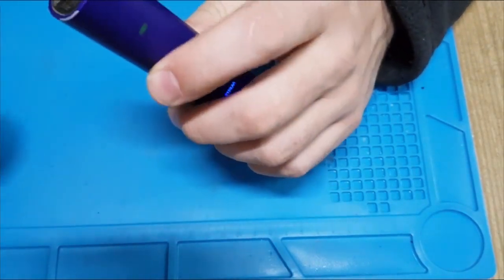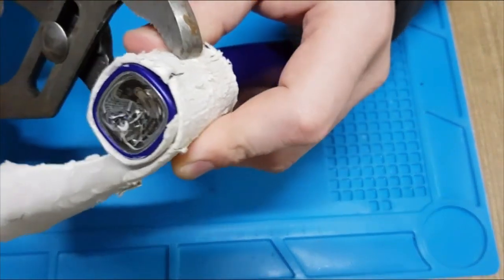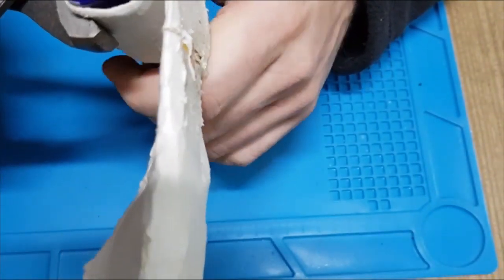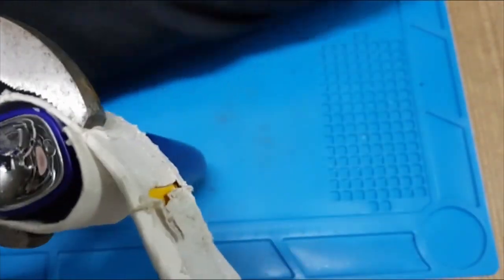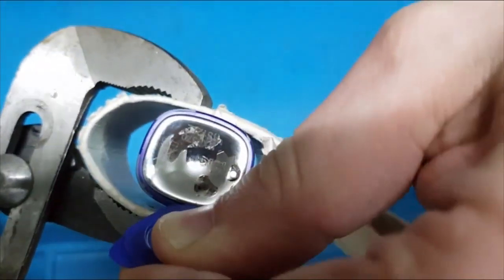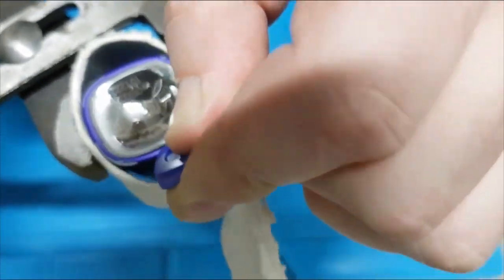It's quite non-destructive. You just take a thicker paper, or something like it to avoid damaging the paint, and squeeze it slightly on all parts to get a bigger opening. And when you have it, you insert some spacer into the side of it, and then rotating it, you press once more on the side, and it usually pops out quite easily.